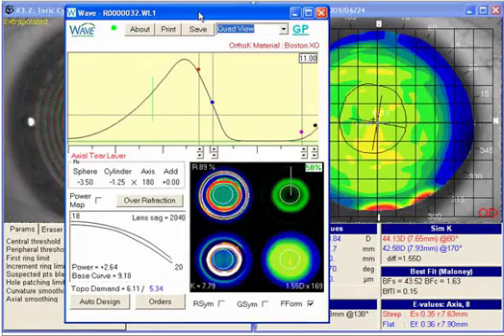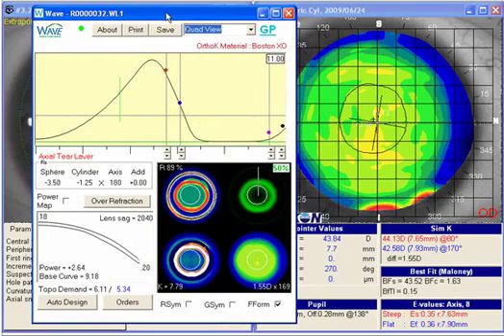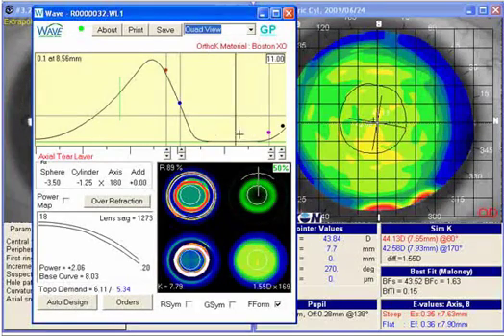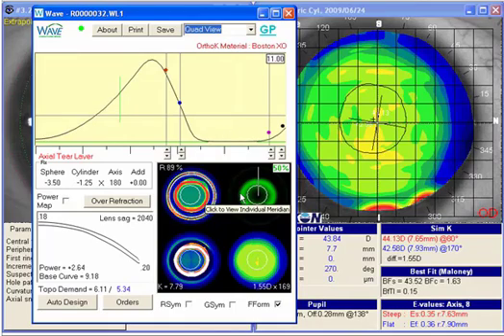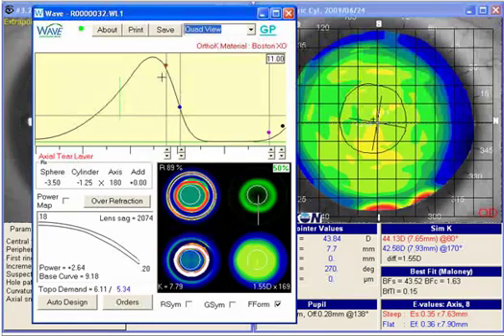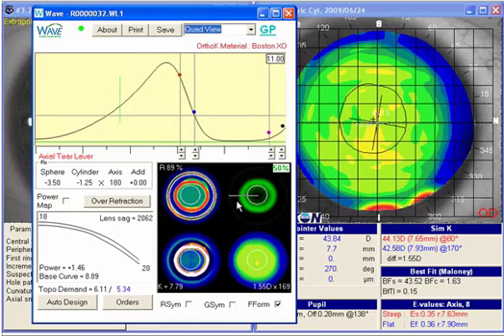And one closing note I want to make on that is, remember with an Ortho-K lens, it only fits the cornea out in the periphery. This little area out here is the only part that's actually lining on the cornea. So when we create the oval, we get a little more alignment out in the periphery, which helps centration, and also by closing in the OZ, we get a little more compact treatment zone, which should help out with the cylinder as well. So between those two factors, we usually get fairly good alignment.